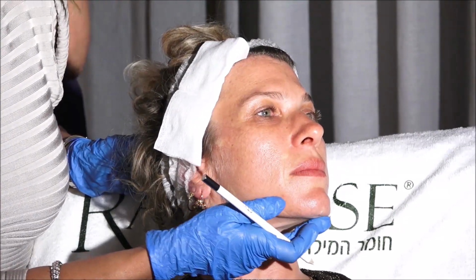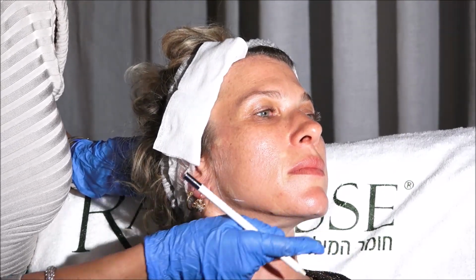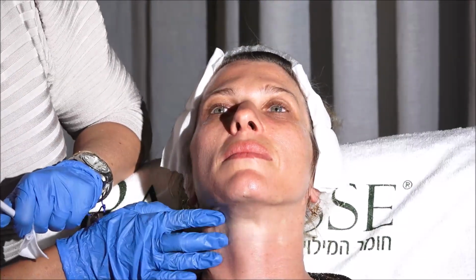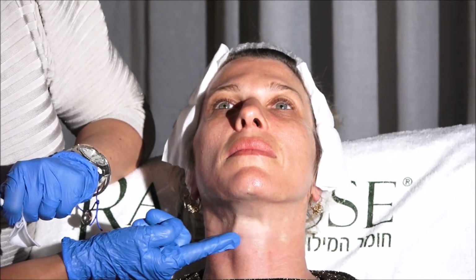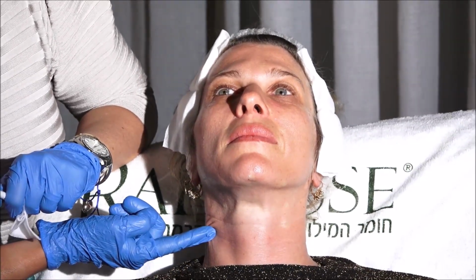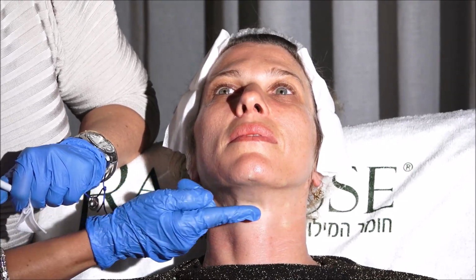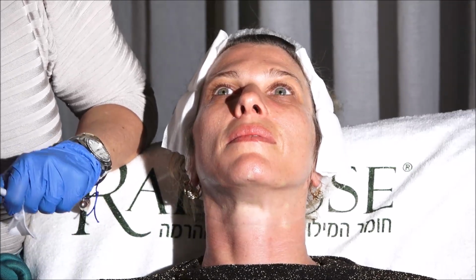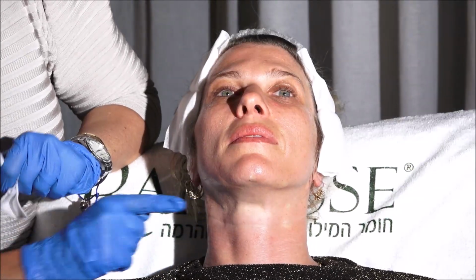So I'm going to use 1 syringe of Radiesse Plus or Radiesse non-dilute for chin and jawline, both sides half and half. I'm going to use Radiesse dilute for the neck, to improve not only this skeletonization she already has, but also the horizontal necklines. But it won't correct completely, so I will need some skin booster here. I'm going to use Revive diluted in this area to correct the wrinkles.